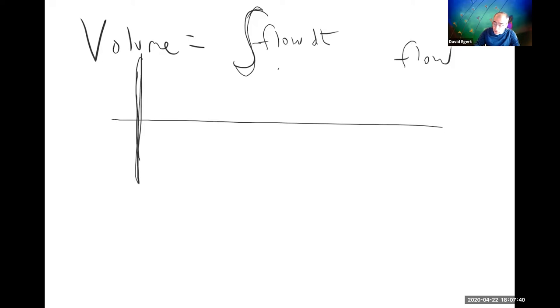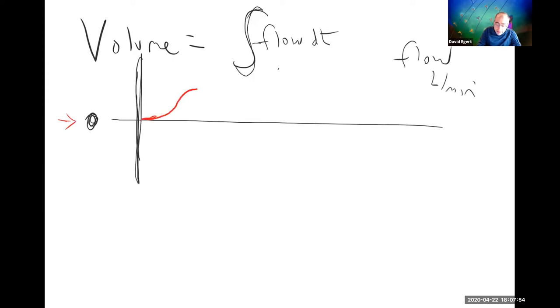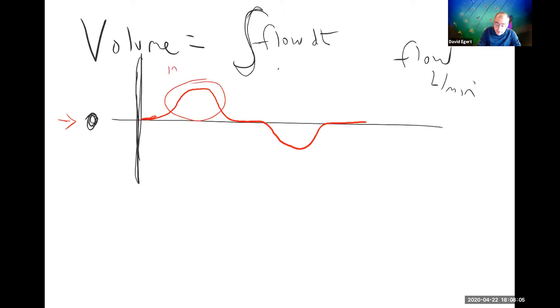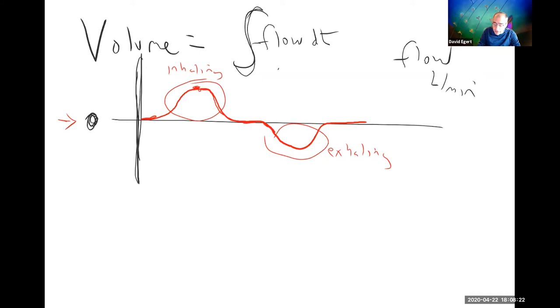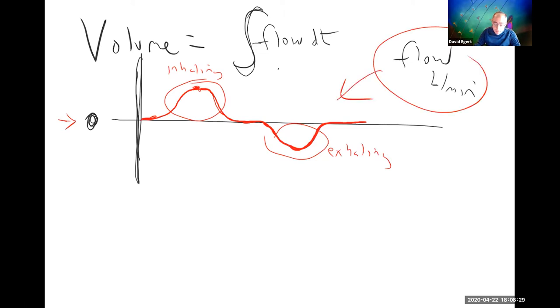We'll have one graph that's flow in liters per minute. At zero, you're holding your breath — nothing coming in or out. When it's positive, I'm sucking in. When it's negative, I'm blowing out. Whenever the value is larger positive, I'm inhaling faster; smaller positive means inhaling slower until holding breath again. Now I'm starting to blow out slowly at first, then faster, then less. So this top graph is flow in liters per minute.